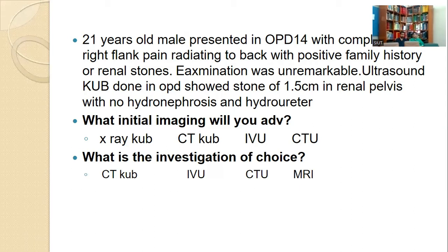Dr. Daniel, please, can you comment on this scenario? I would advise X-ray KUB to show whether the stone is radiopaque or radiolucent. Yes, that's the point. I want to stress X-ray KUB after ultrasound. You are in OPD 14, and in this scenario, after ultrasound, go for X-ray KUB.